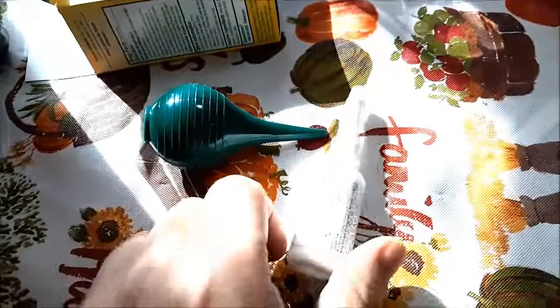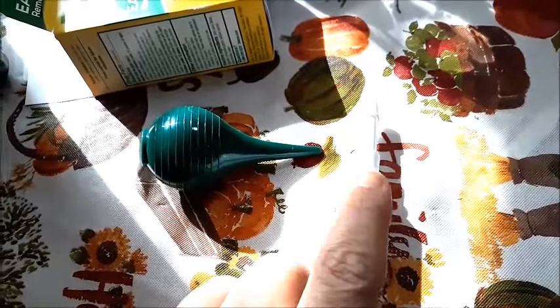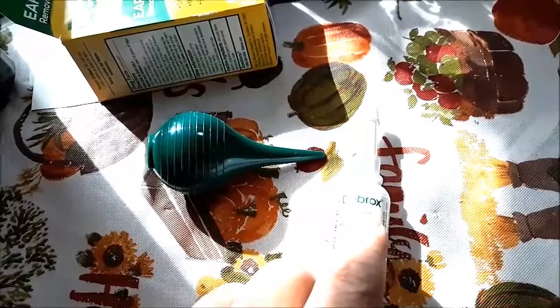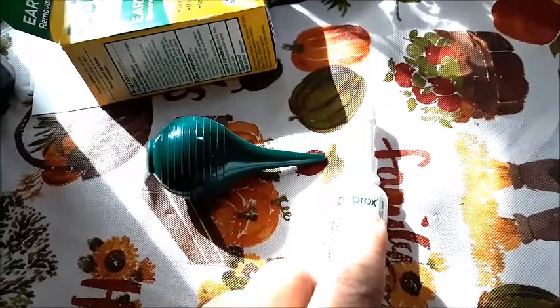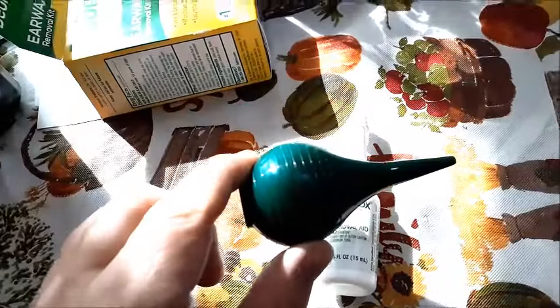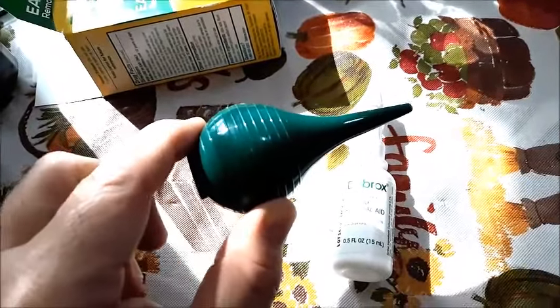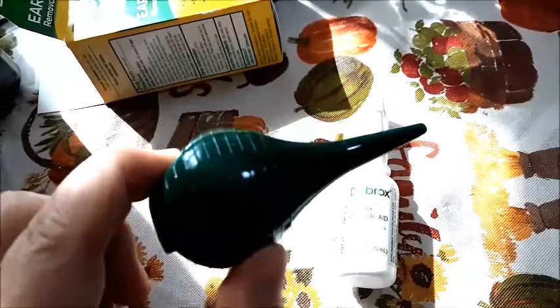So it comes with a little rubber syringe and the actual ear drops. What you're going to do to apply it is put five to ten drops in your ear twice a day for at least three days. You do not use the syringe until the very last application — so probably after three days, then you would actually use the syringe.